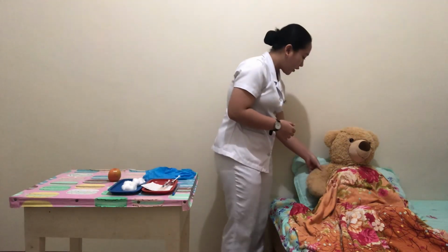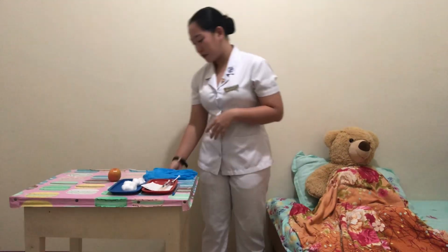So the site for injection should be 3 to 4 finger widths below the antecubital space, and 1 hand above the wrist. Avoid using sites that are tender, inflamed, or swollen, and those that have lesions. So now perform hand hygiene and observe appropriate infection prevention procedures.